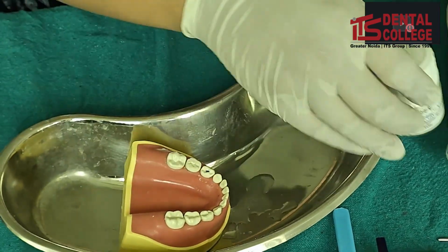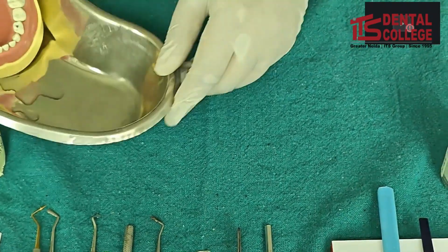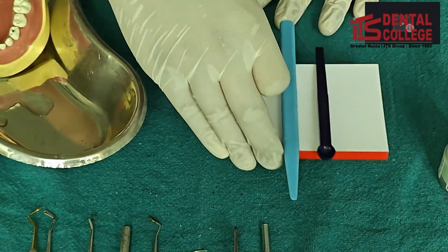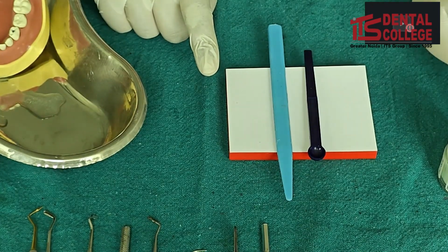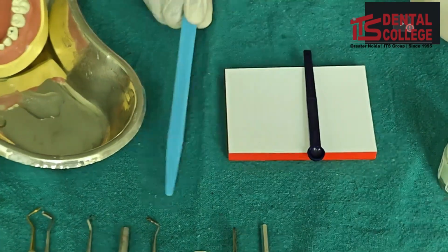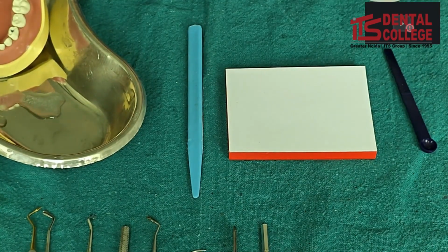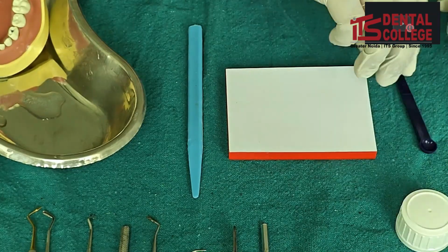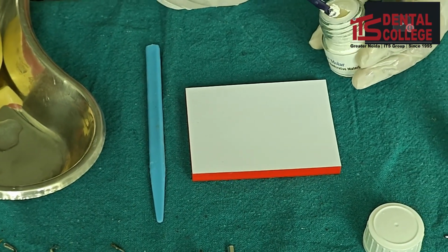For manipulation of glass ionomer cement, the powder and liquid are taken in a ratio of 3:1. That is 1 scoop of powder and 1 drop of liquid. So here I am dispensing 1 scoop of powder.